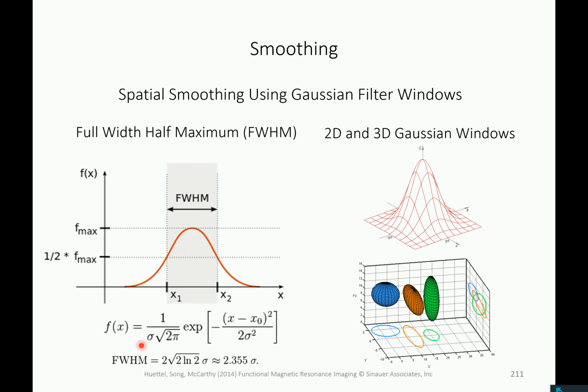Of course, the data we are dealing with is actually not one-dimensional, but two-dimensional if you do it slice-wise, but you actually do it volume-wise, so it's three-dimensional. So you basically use 2D Gaussians or 3D Gaussians, and you see the isocontours here. This is kind of the task to familiarize you a little bit with multivariate Gaussians, so look into that. There's a whole chapter in the PMFN on multivariate Gaussians. They are just extensions of the univariate thing to more than one dimension.